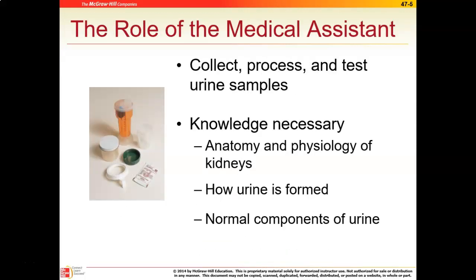Okay, and so as you go through, urine is actually a very inexpensive test, and I've had a few clinicians and PAs through the years tell me that there are certain tests that are very inexpensive, so don't ever hesitate to do them, because you can get a lot of information from certain tests. Pregnancy testing, urinalysis, hemoglobins, blood sugar, and glucose are very inexpensive and easy to do. Urine is one of those that's very simple, but it actually gives you a lot of information about that individual and that individual's health.